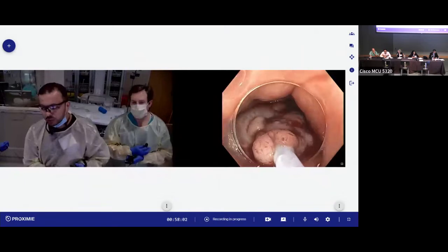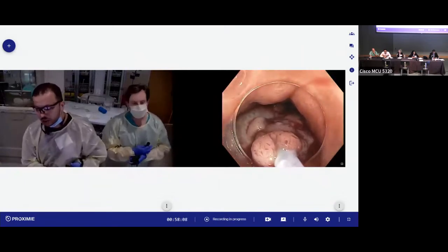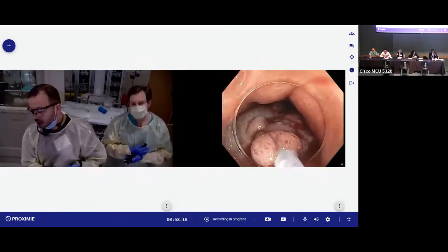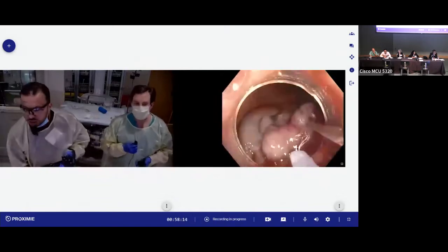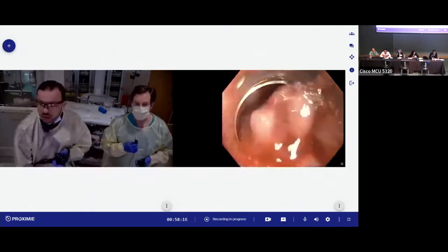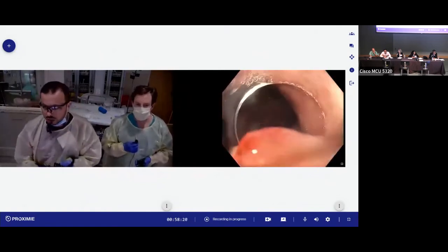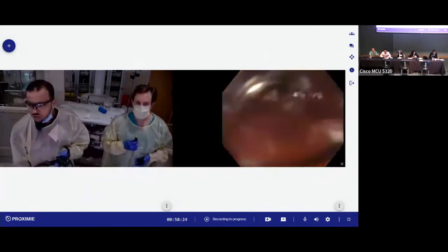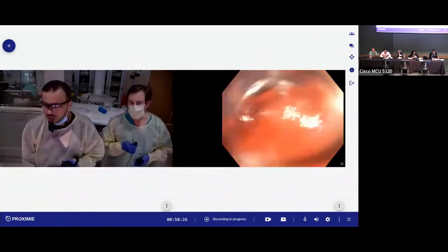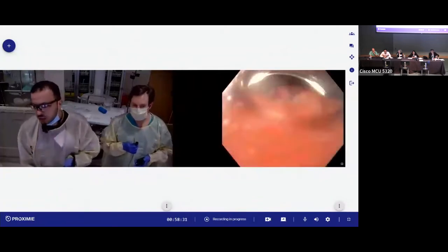There's a lot of fibrosis. It's really hard to get to the hub with these kind of patients. So we're going to go slowly with me on the cautery. 1, 2, and 3. Go ahead. Good. Okay. So we have the first bite, and sometimes with the first bite, your intention is just to go into the submucosal space. Perfect. Always assess that resection site.